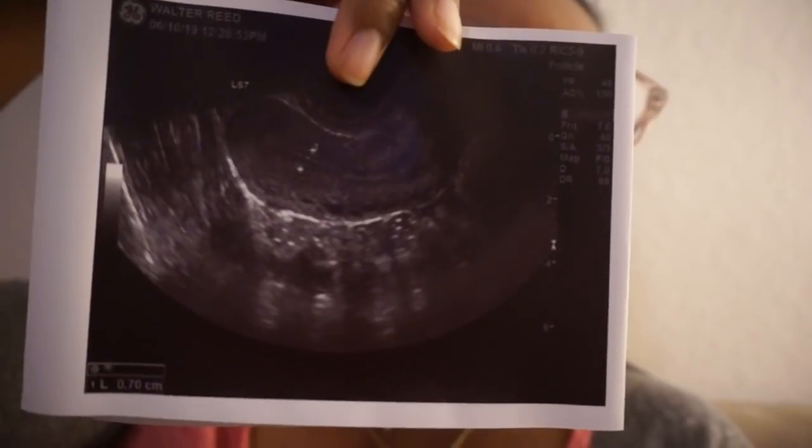As you guys know, she took the vaginal ultrasound and she checked my uterine lining. My uterine lining was measuring at a 7. She said it looked good. That's what she wants to see, like some 3-layered look or something. So I have a picture of it. Let me make sure I have it the right way. I don't even know if you guys can really tell. All right, yeah, there you go.